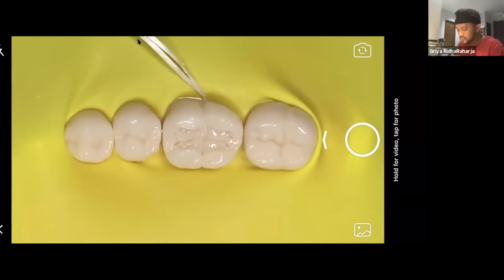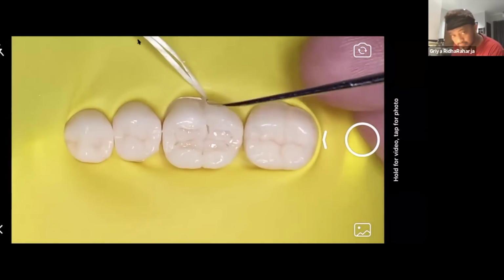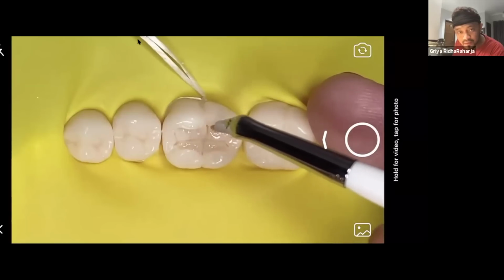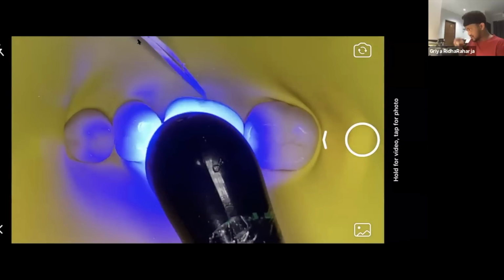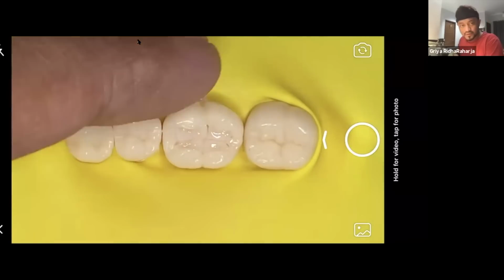Okay, so after this, you can cure, and then you can place some stain to create a map, to draw the line, to guide you to the internal space. So, like here, and then put the stain. Okay, you can use brown stain. Brown stain.